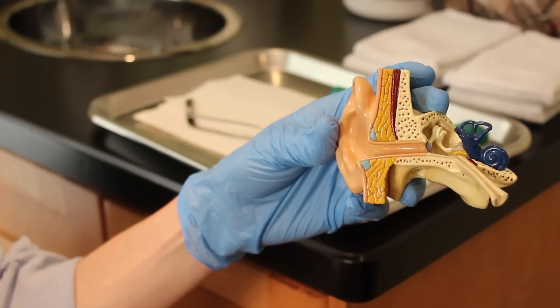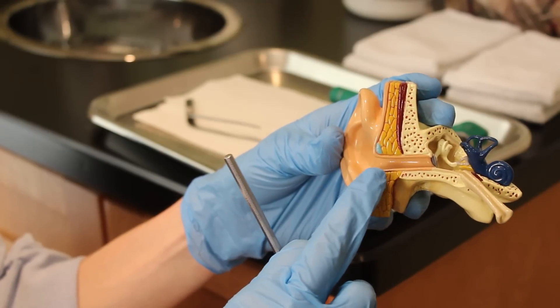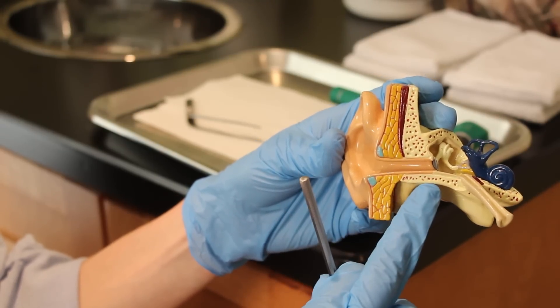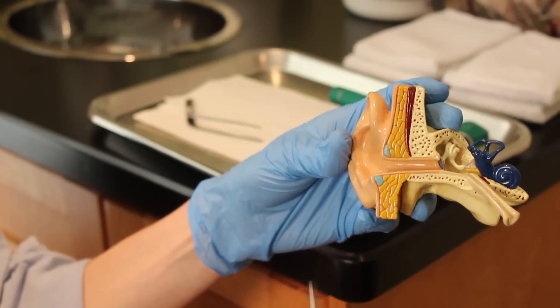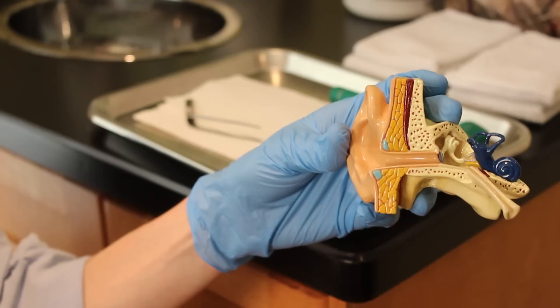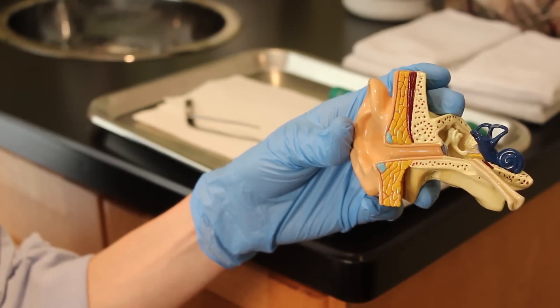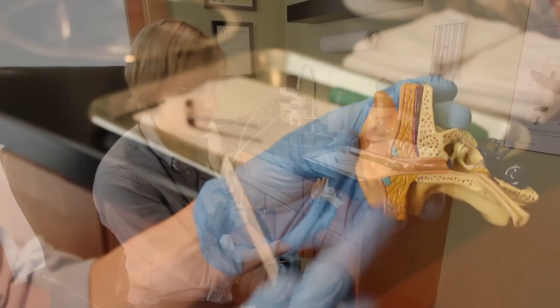Now there's a very thin lining of skin over cartilage, and then your ear canal about halfway down turns to bone and there's a very thin lining there. So if I touch down on that with my curette, you'll feel it — you'll feel a sharp poke. But I'm nowhere near the eardrum so I'm not going to traumatize anything, but you'll feel some discomfort there.